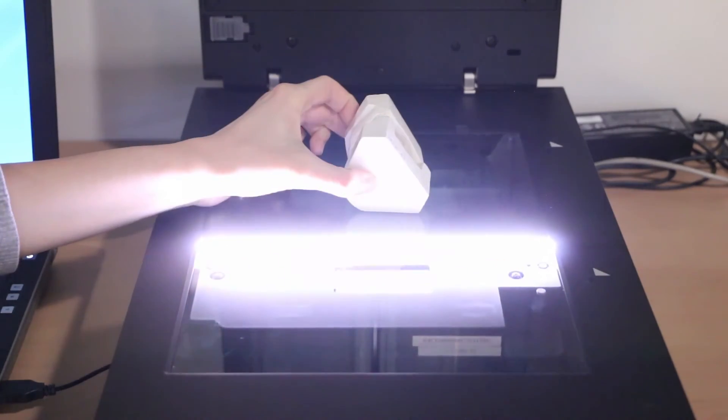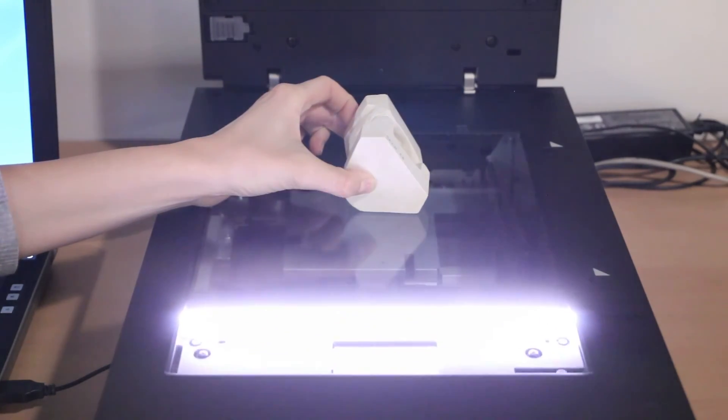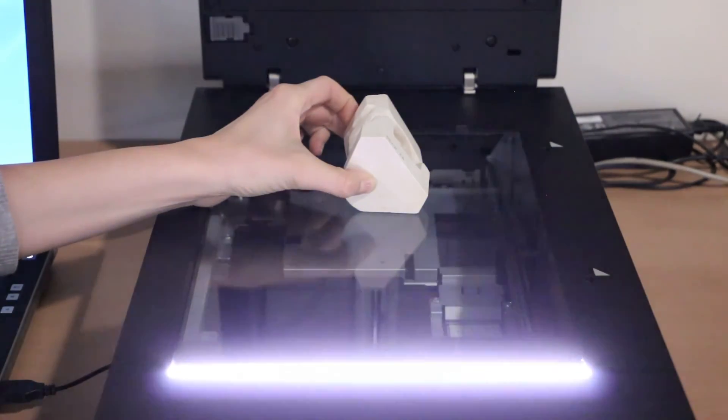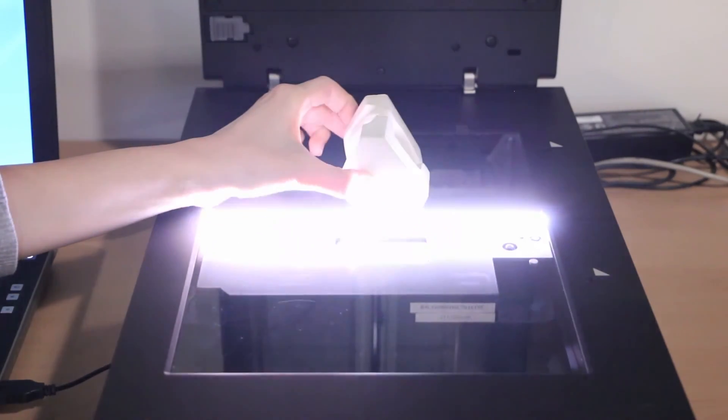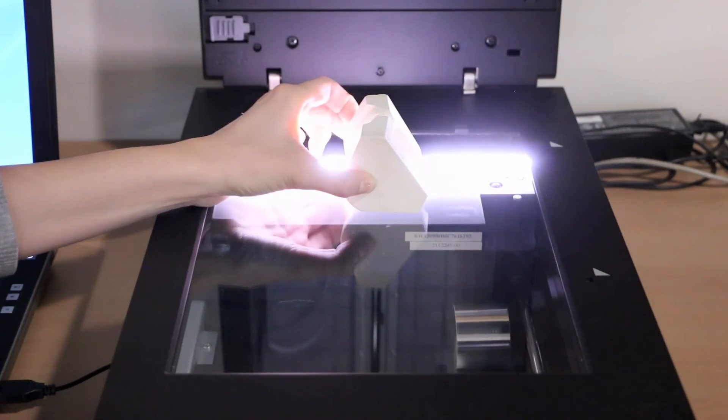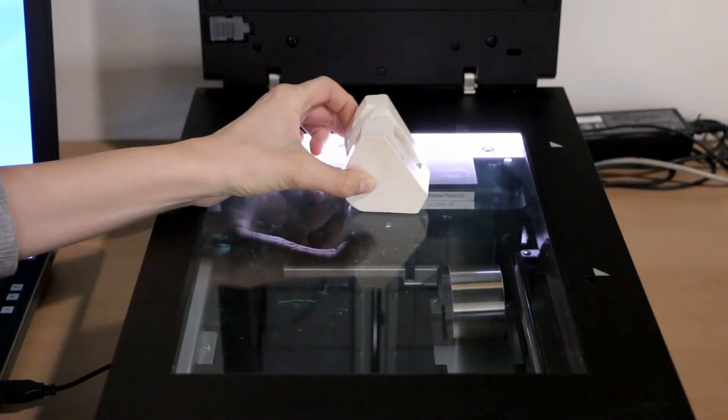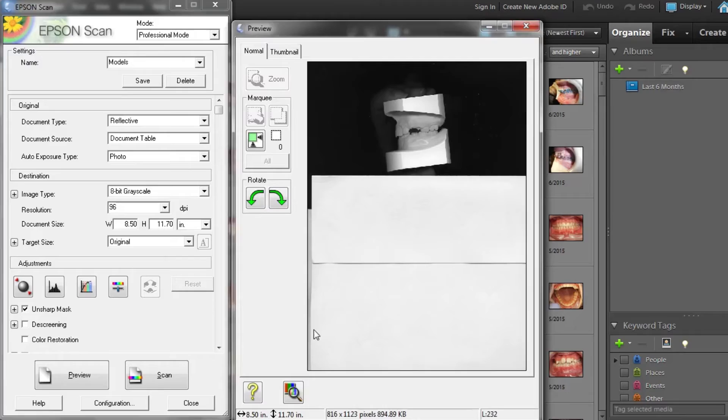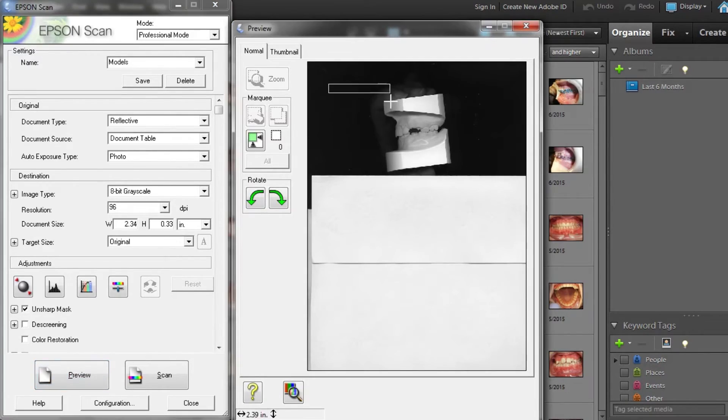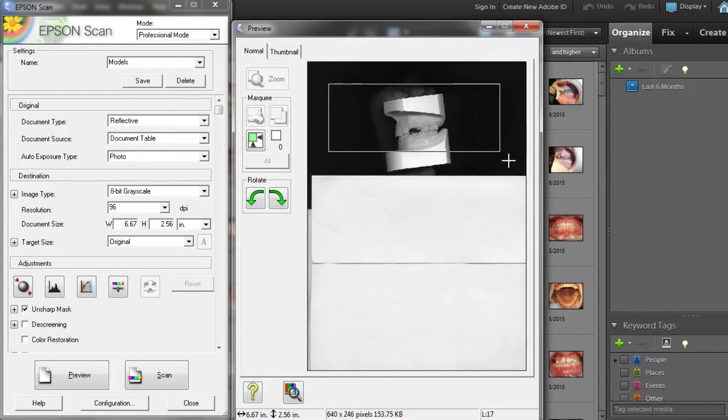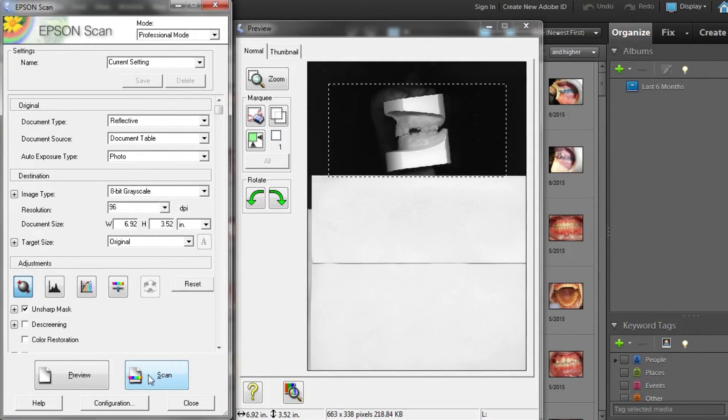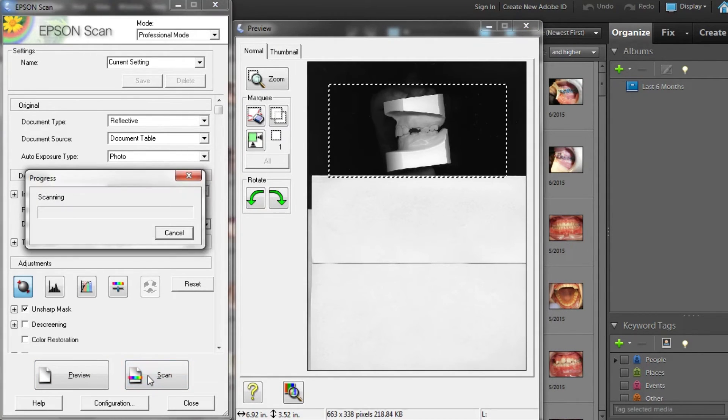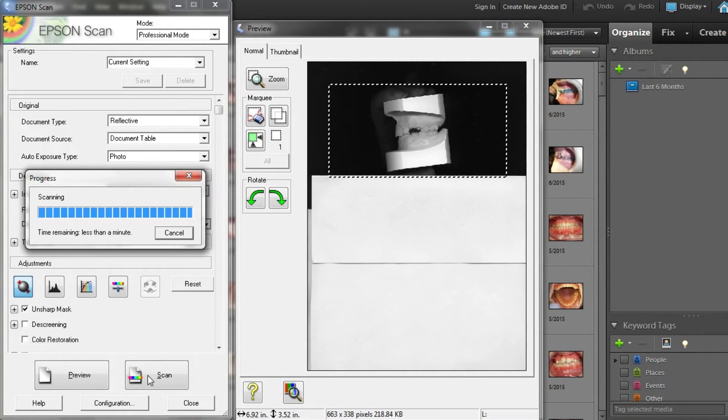Hold the models in place on the scanner screen with your hand, doing one side at a time. Select Scan and then repeat steps for the other side. No need to preview because you are going to rotate and crop in Photoshop.